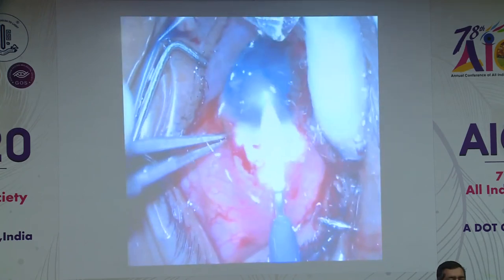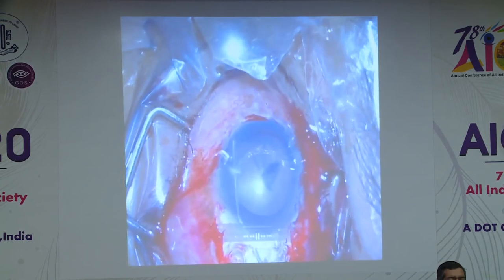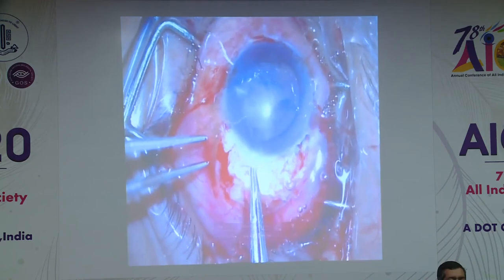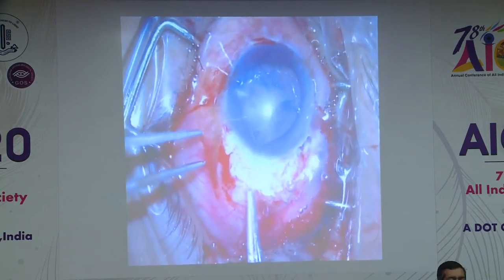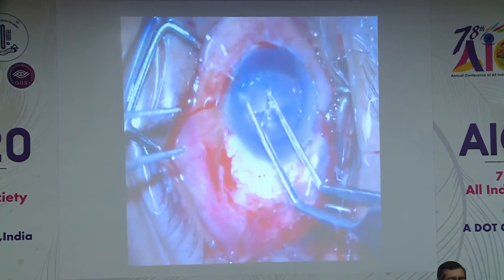So I went ahead and I did first a phaco. In a sense, I've done a rexis here. You can see I'm nudging the glass foreign body lying in the angle area. And I first removed the glass foreign body. Yeah, this is the glass foreign body coming from the angle area.